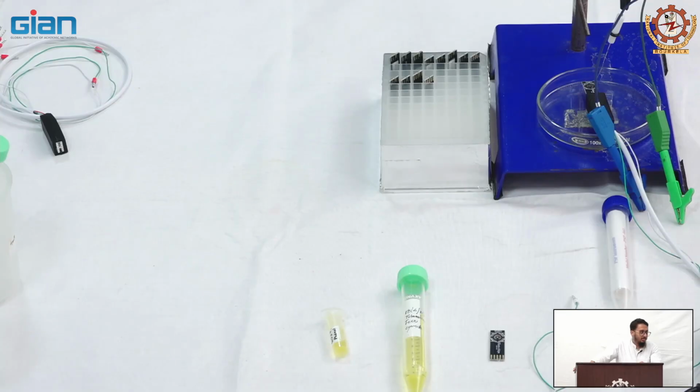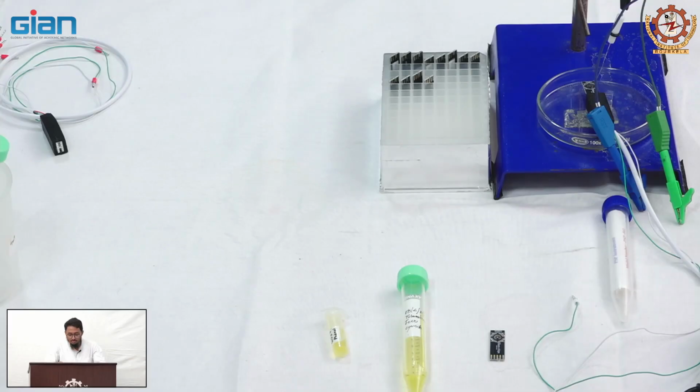So moving on, we are going to start the experiment by checking the consistency, fidelity and stability of the working electrode. For this we will be using the potassium ferrocyanide as a redox reagent, and we are going to use an external platinum based counter electrode to do the working electrode check.